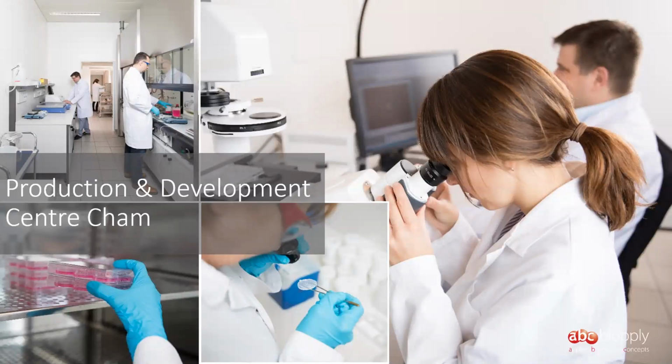Then another question is, can you reuse the chips for multiple experiments? No, the chips have been designed for single use only.